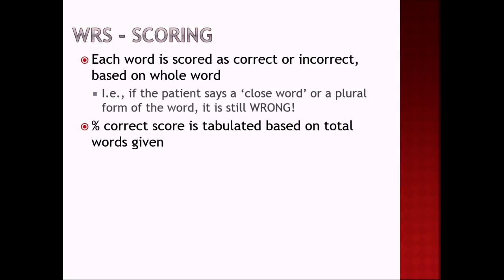Those tend to be word lists that are used for cochlear implant listeners or people with lower level auditory skills, where if you did whole word scoring, like an NU6 or W22 with whole word scoring, they would bottom out. They would end up at 10% correct. And then in that case, you may want to move to a phonemic word list, or a phonemic scoring word list.